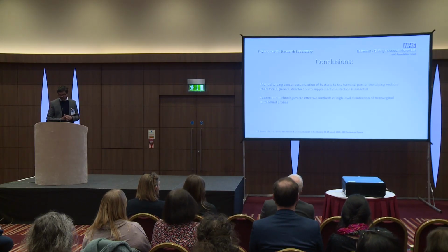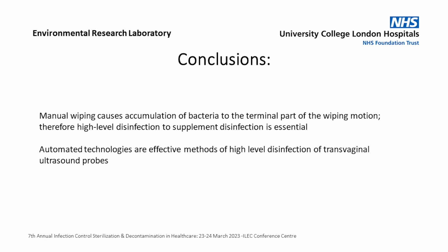So what we concluded from these is manual wiping can accumulate bacteria at distal parts of the probes, though all of the processing techniques we used were effective, and we found that automated technologies are also effective as high-level disinfection of transvaginal ultrasound probes.